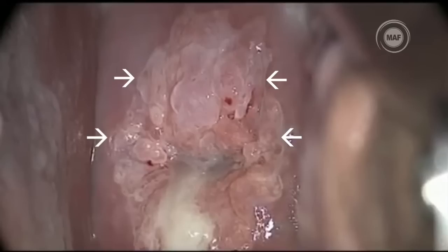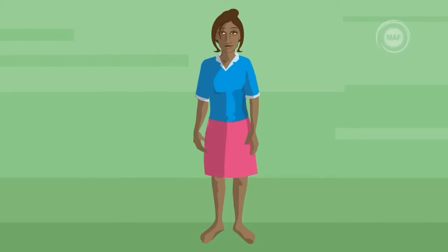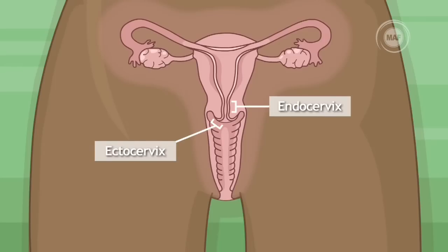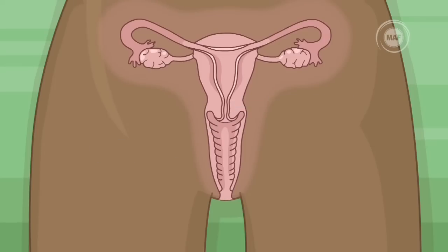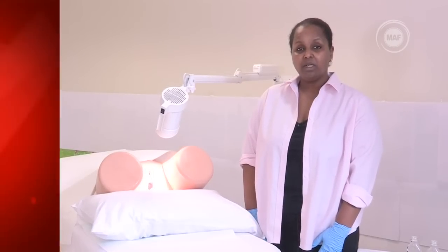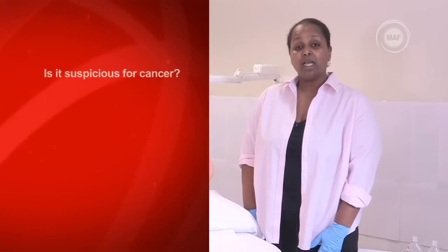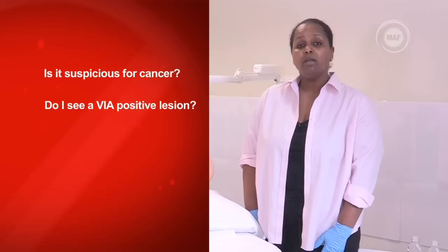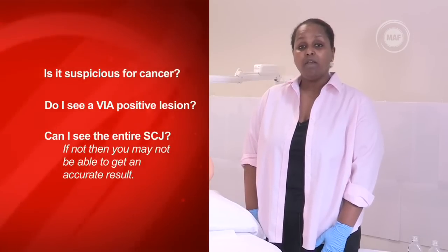This is called aceto white and will occur within the transformation zone. It will have clear borders and starts at the squamous columnar junction or SCJ — the intersection between the endocervix and the ectocervix, and where abnormalities start. Normal cells remain pink after applying the acetic acid. When observing the cervix, ask yourself: is it suspicious for cancer? Do I see a VIA positive lesion? Can I see the entire SCJ? If not, you may not be able to get an accurate result.